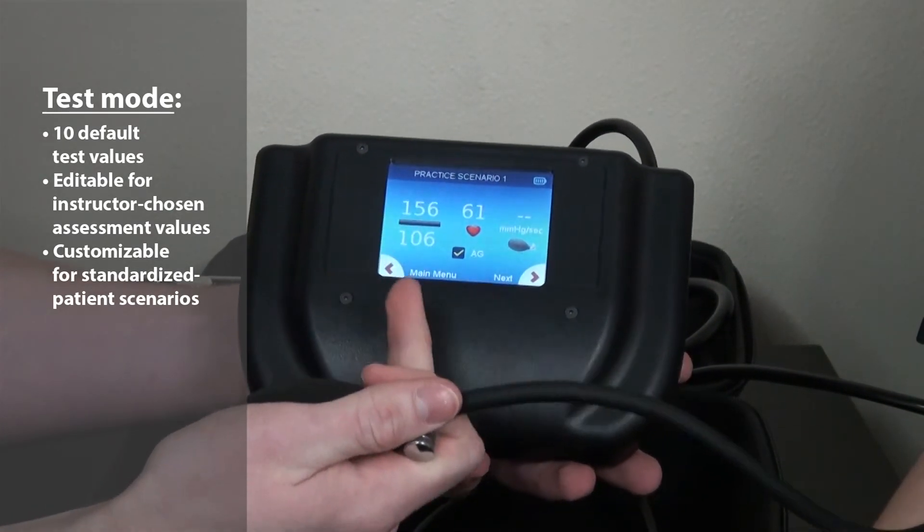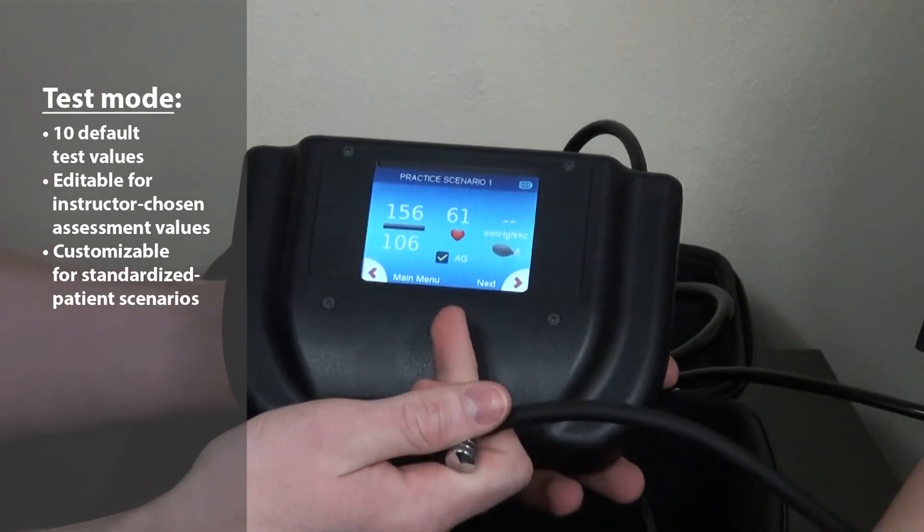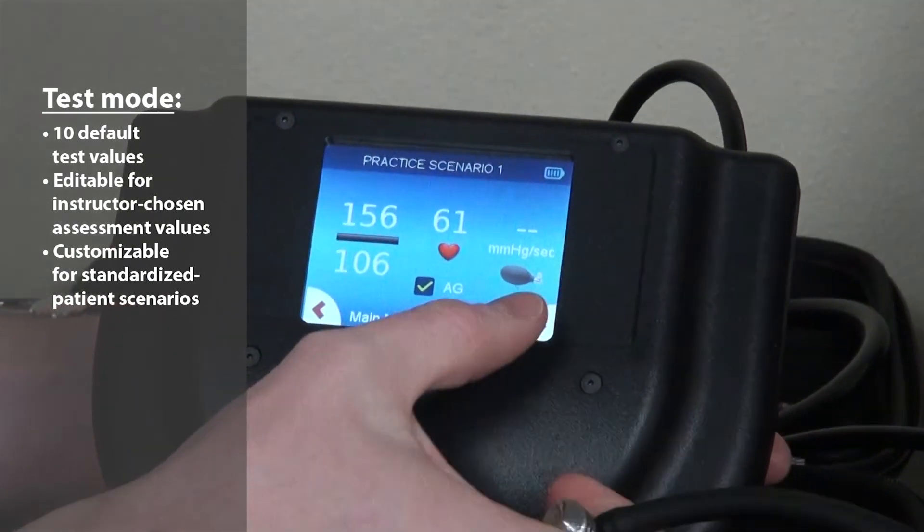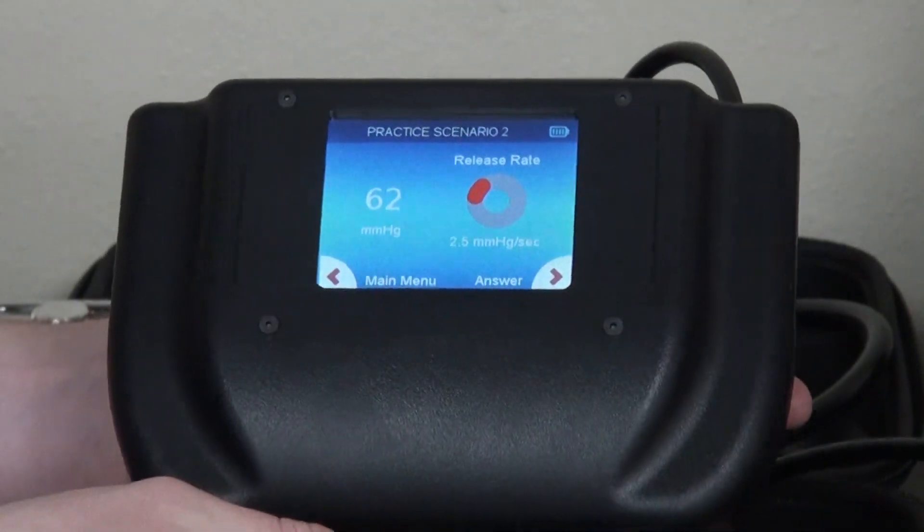The next screen shows your blood pressure answer, heart rate, as well as your average release rate. And then we can go on to the next random sample.